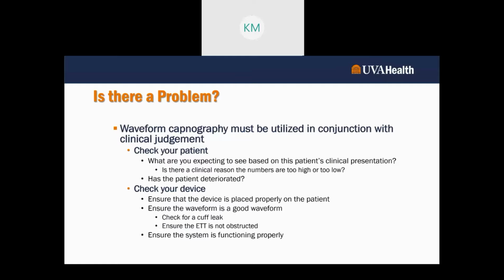And if you go through and assess your patient and life is good, then it's time to check your device, right? I don't know if you guys have ever seen toothbrush VFib. It's when you're monitoring a patient on telemetry, and all of a sudden you see them go into VFib and everybody and their brother busts into the room and they're just sitting there with a mouthful of toothpaste because they're brushing their teeth. Okay, check your device, make sure it's working properly, make sure it's not something the patient is doing, right?